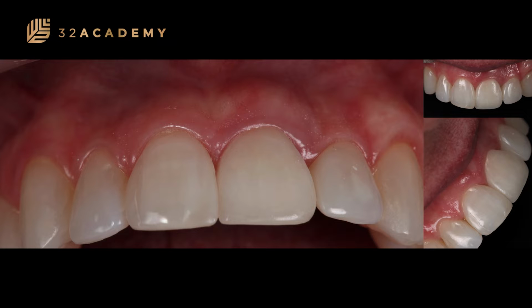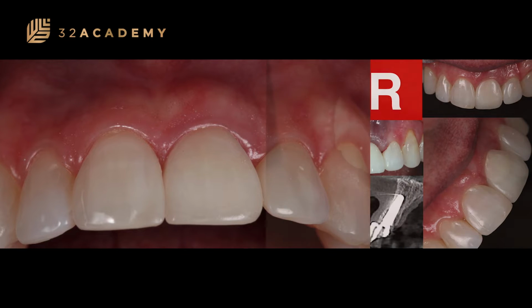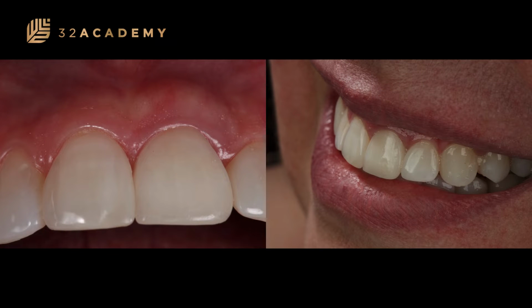So we did the scanning, we did the final porcelain restoration with ideal emergence profile, and you see here the follow-up after 2 years. Everything is being maintained in the right position. So we have here the balance between the lips, the gingival architecture, and the final porcelain restoration.